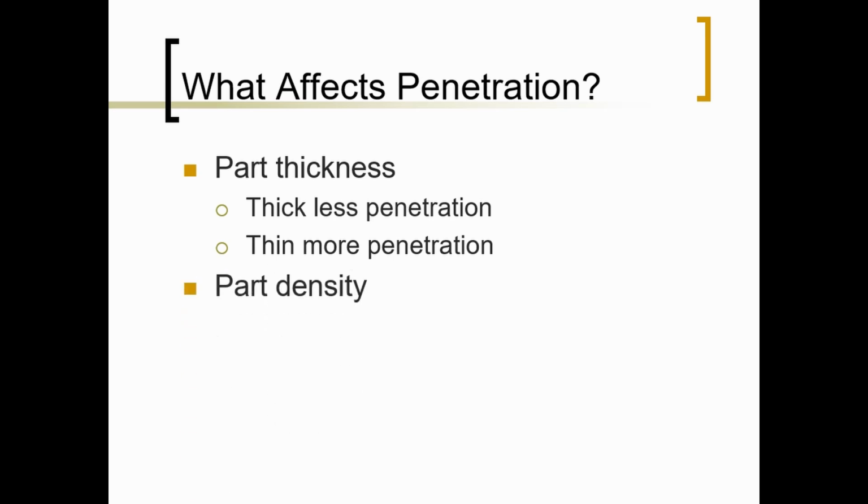The density of a part also affects the amount of radiation penetrating a patient. Most of the densities in our body can be attributed to the amount of calcium present in a given tissue or organ. The more muscular the patient is, the less radiation penetrating the patient's body. Muscle is denser than fat. Muscles contain more calcium than does fat, so adjustment of the technique may be necessary for knees to pelvis and elbow to shoulder exams for heavily muscled individuals.